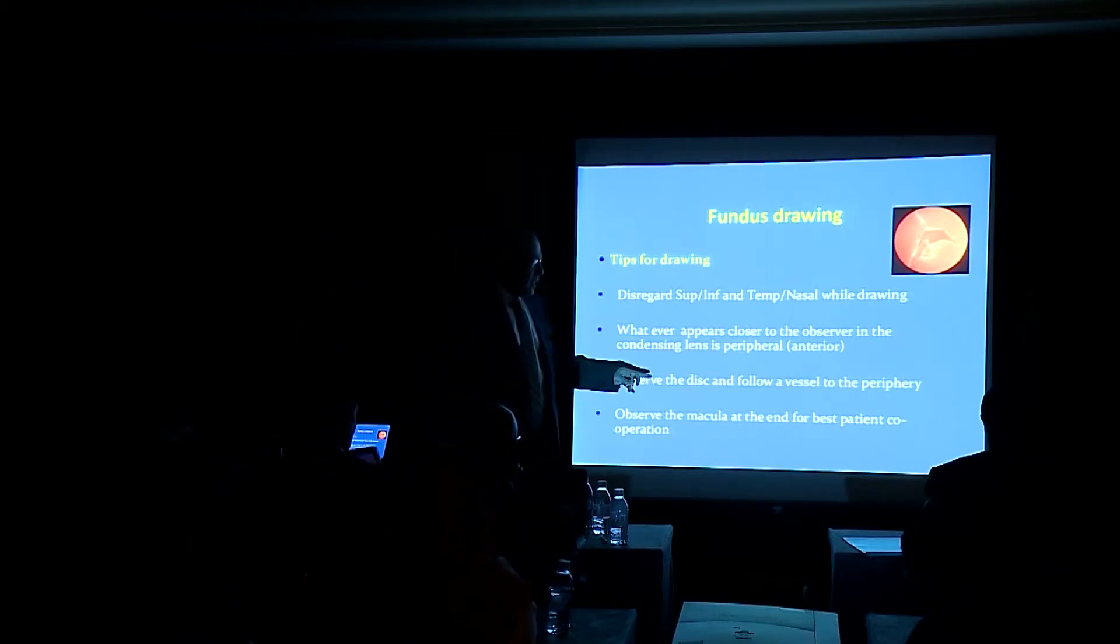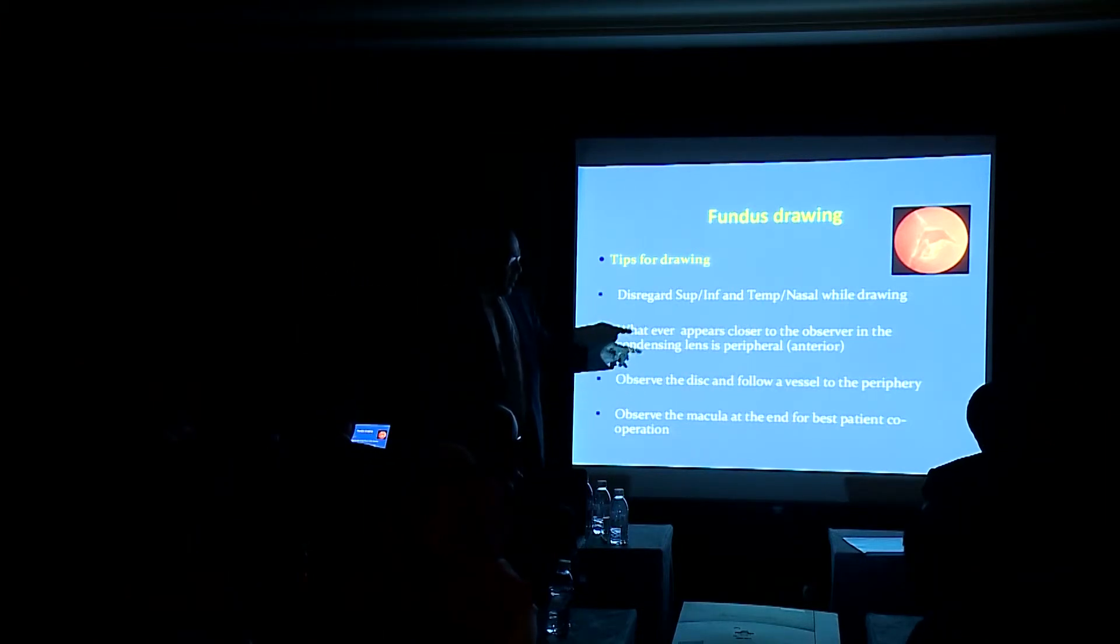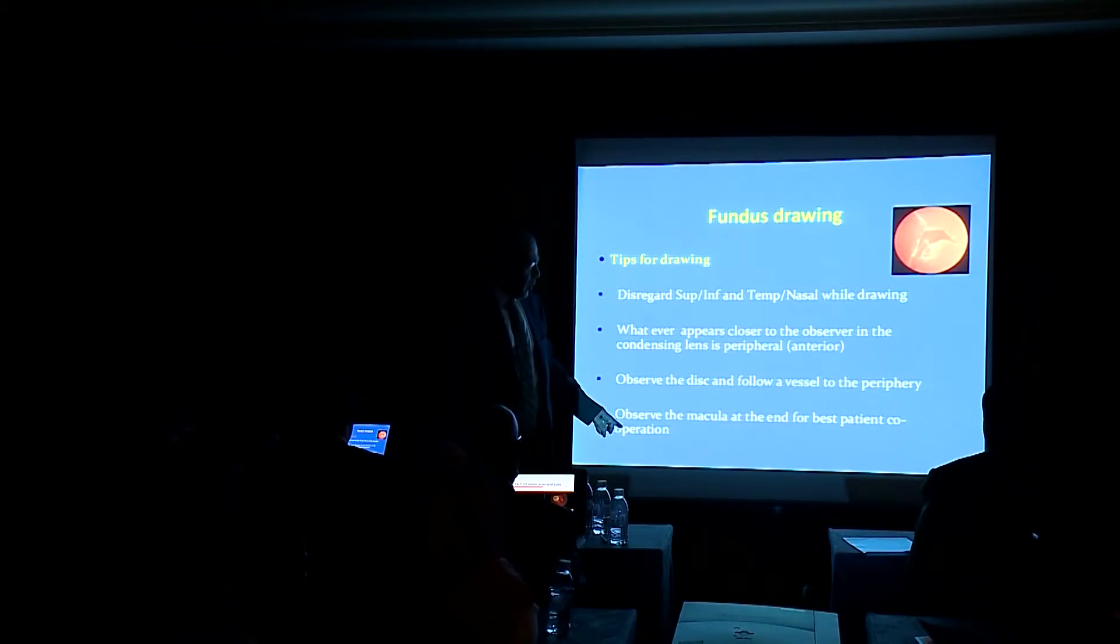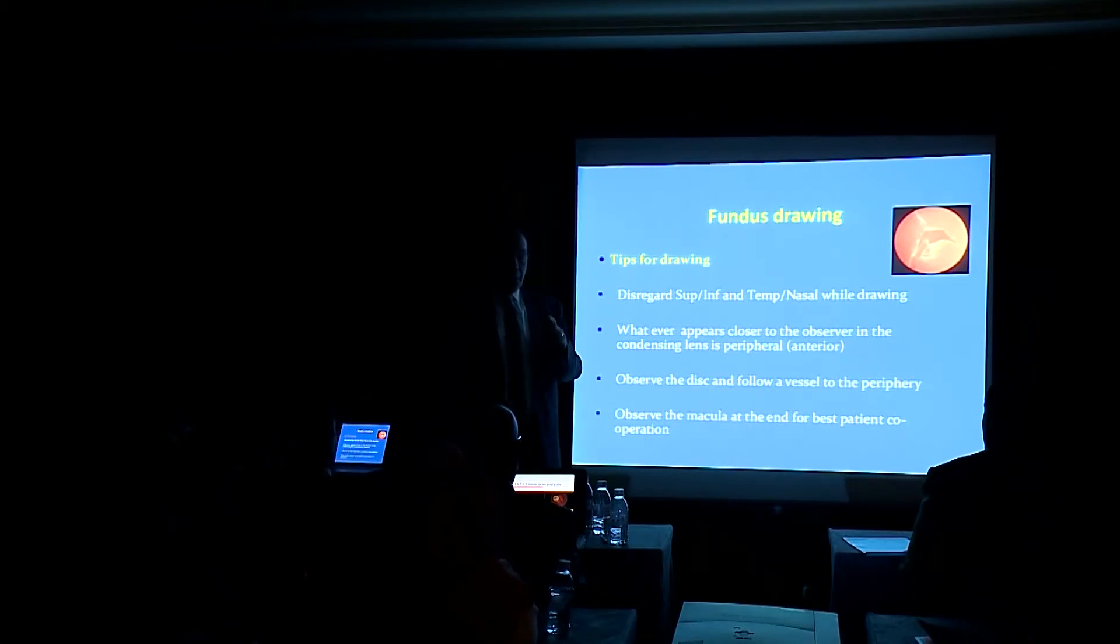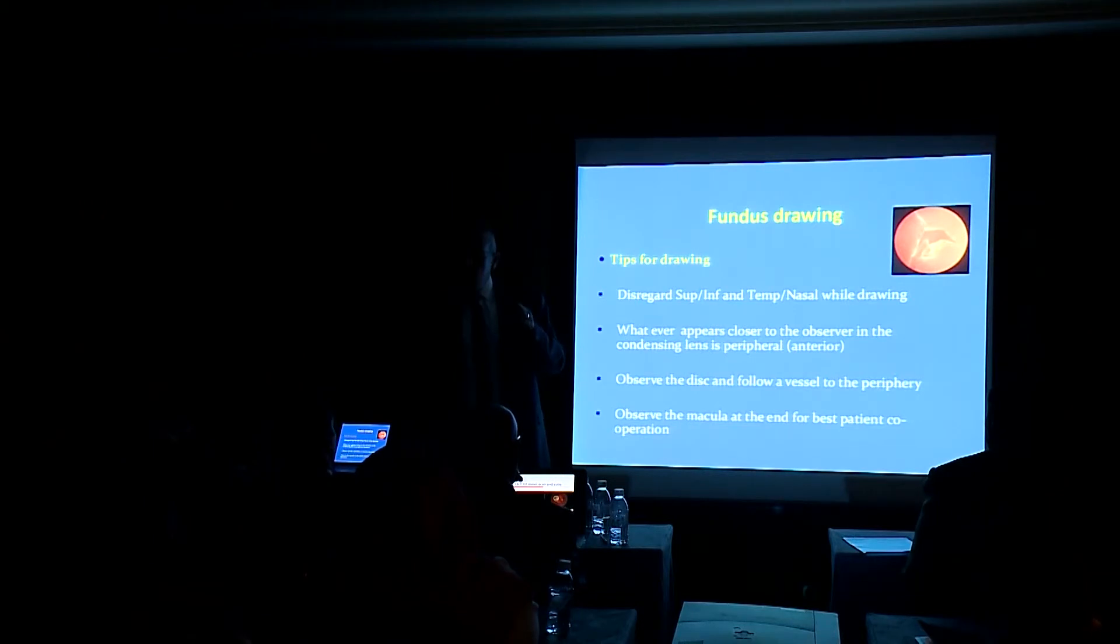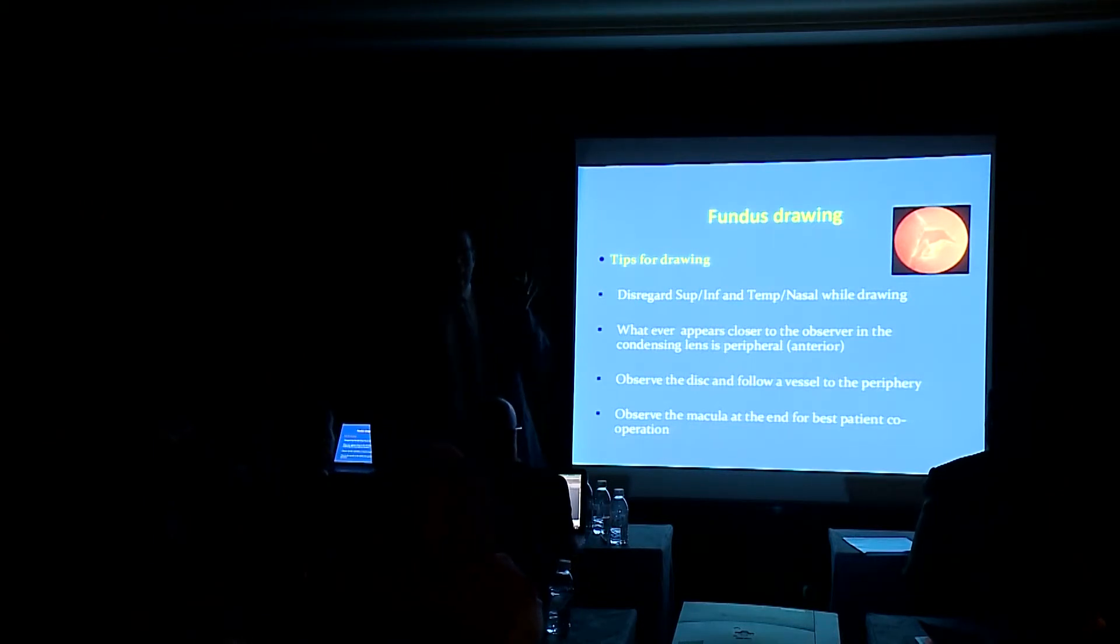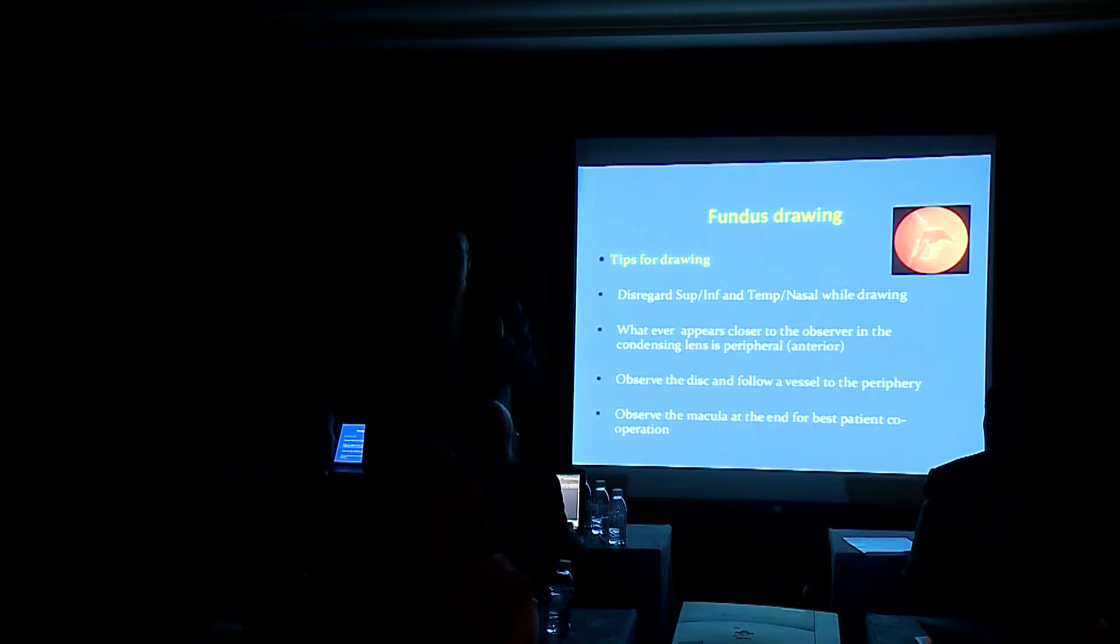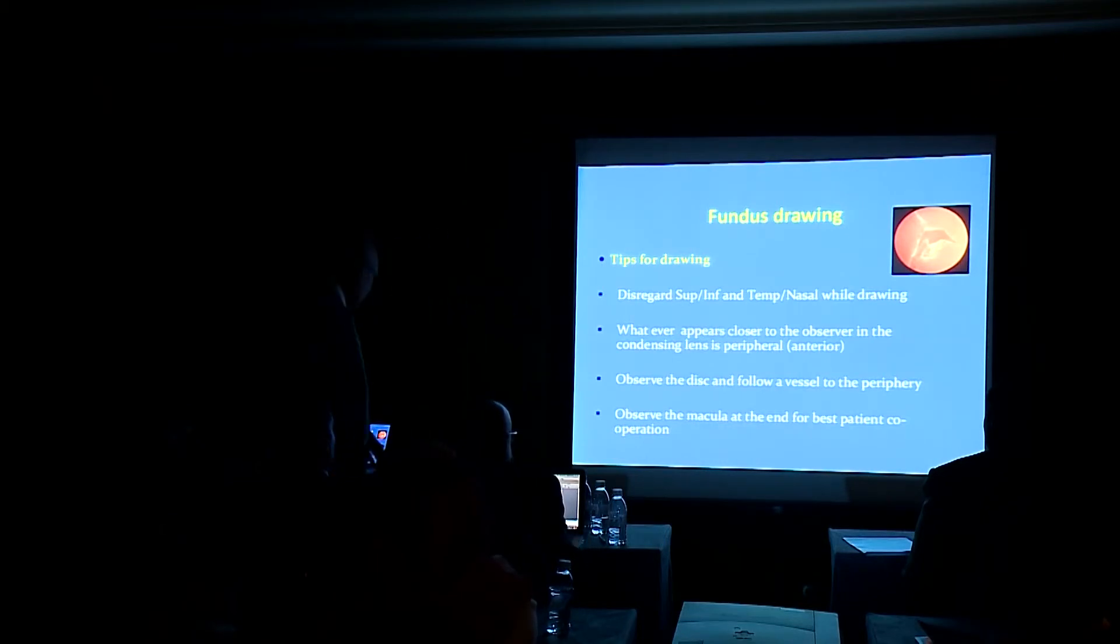Observe the disc and follow a vessel to the periphery. Observe the macula at the end of the examination because if you start in the beginning, it will be very harmful to the patient and the pupils will close and you will see nothing in the next steps.